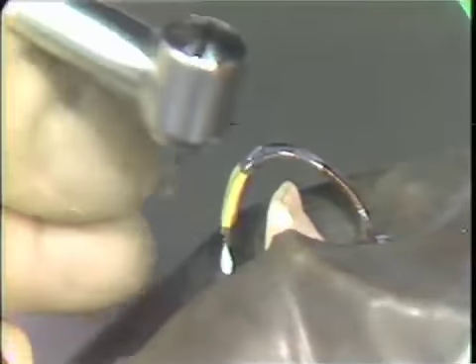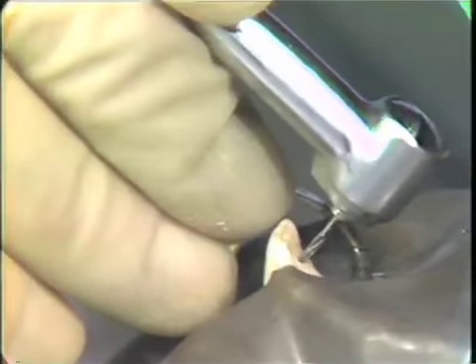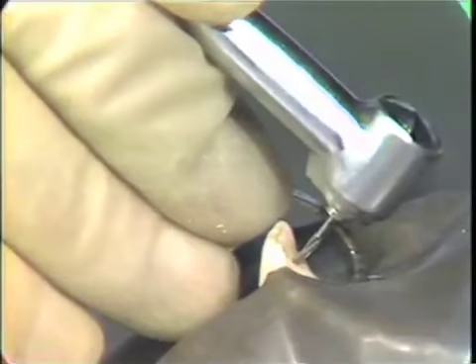Then you take a very good look at the crown of the tooth, the angulation of the tooth, and your initial radiograph, and visualize exactly where that pulp is and what your tentative outline form is going to be. Once you have that very definitely in mind, with a high-speed handpiece with a 1057 burr angled at right angles to the surface of the tooth, you establish your tentative outline form and drop down through to the dentin.